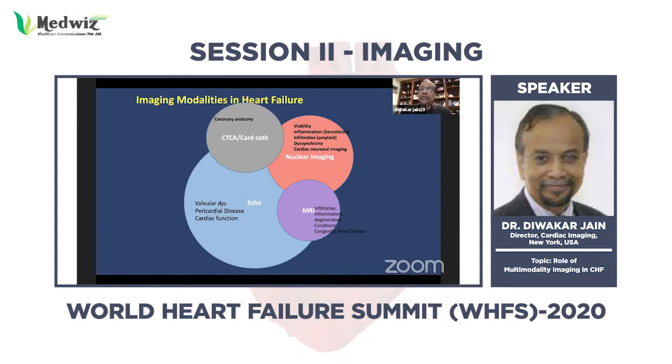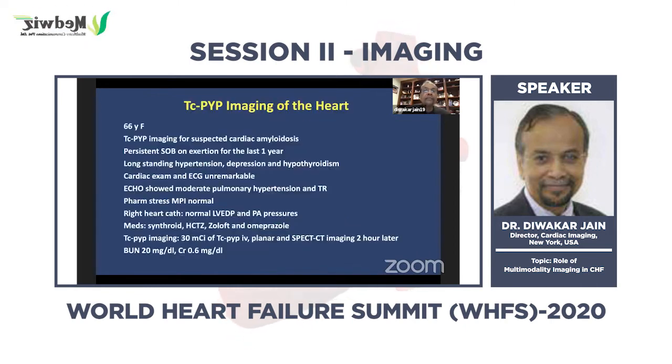Dyssynchrony can be an important contributor to left ventricular dysfunction in patients with pre-existing left ventricular dysfunction, and identification of dyssynchrony and its correction by appropriate electrophysiological technique can result in a substantial improvement in the condition of the heart. Cardiac neuronal imaging is another important area, which is again unique to nuclear imaging, and plays an important role in the prognostication of patients with heart failure. I will briefly show some data on that.